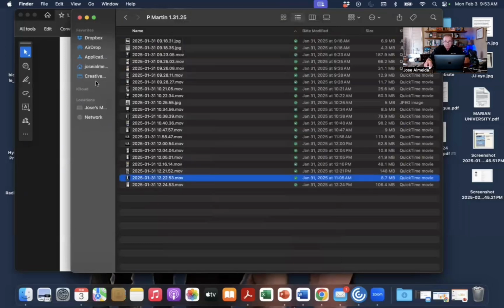All right, so that's the case from this week. What are the lessons? Well, we did get one side open with balloon angioplasty. So really, if one side is open and you've got return of the vena cava, they have preload and they do okay. When the vena cava is completely occluded, they really get a lot of fatigue because they've lost the preload of the heart. And often when the side is open, you will get some cross-pelvic filling and the opposite leg, in this case the left leg with the occluded stent, sometimes that'll improve just by having the right side open. So we're going to give that a chance for a little while.